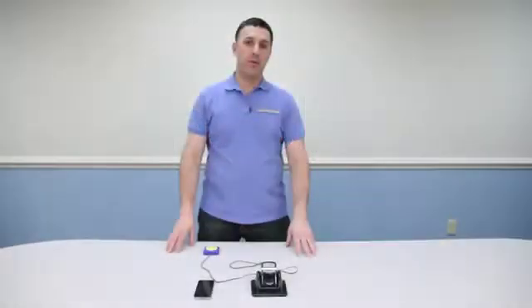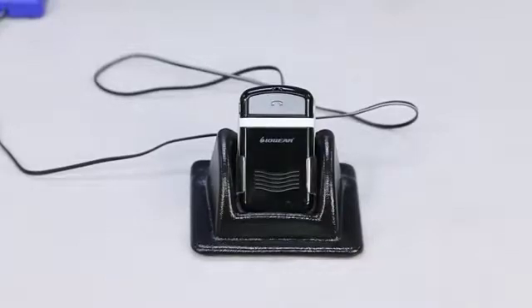Hi, Vinny Lovoda here, tech support enabling devices. Today I'd like to introduce you to one of our new products, the hands-free Bluetooth item number 7760. So let's get started.